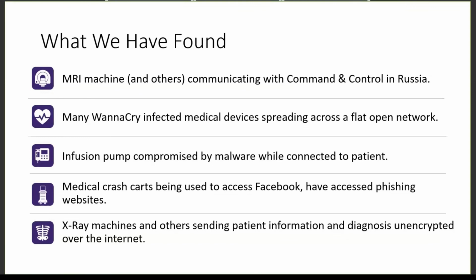These devices were built to be in service and to work for decades in some cases. So in many cases, we are seeing highly vulnerable devices running very old operating systems that are no longer receiving patches, with a wide understanding in the wild of how attackers can compromise these devices. And that's ultimately what led to this event at one of our customer sites.